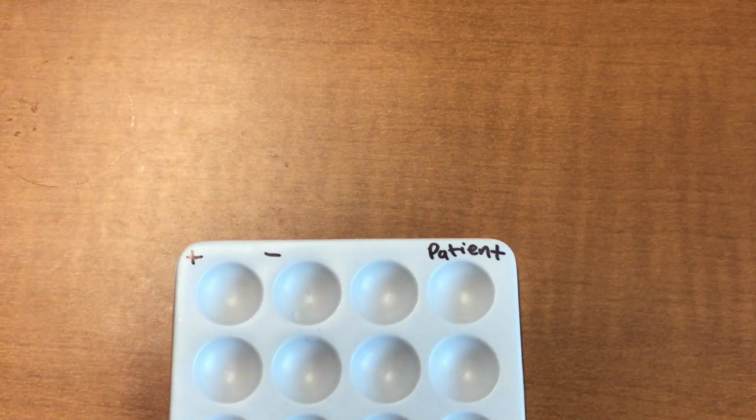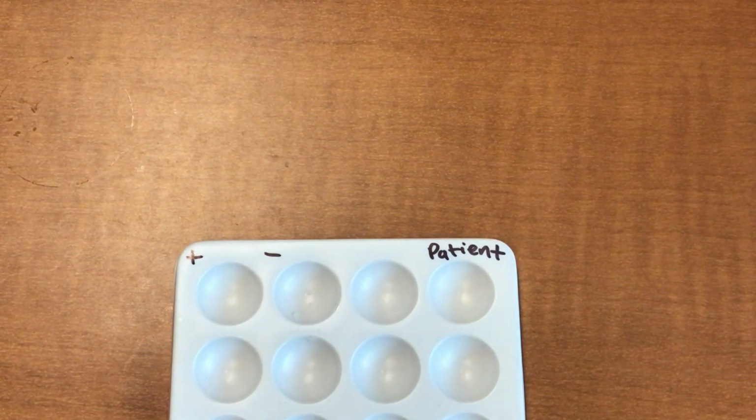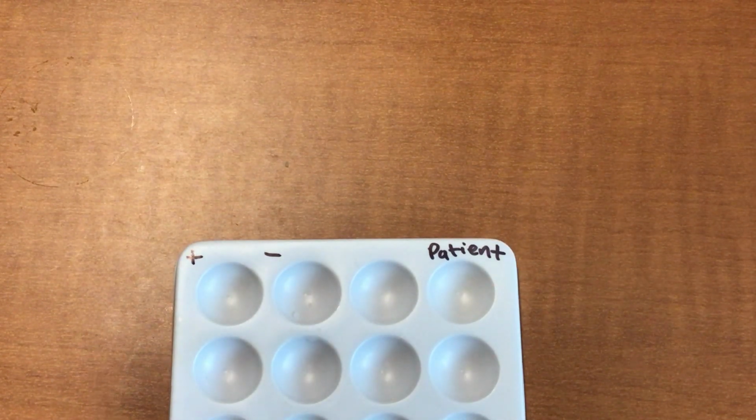Ladies and gentlemen, what we're going to do now is show you how chemical testing is done for a particular disease. So let's say you are a doctor and you believe that your patient has a particular disease. Let's say you believe they have salmonella and they are suffering from salmonella, and you want to test to see if they have the salmonella bacteria living in them. So what you're going to do is order a chemical test.